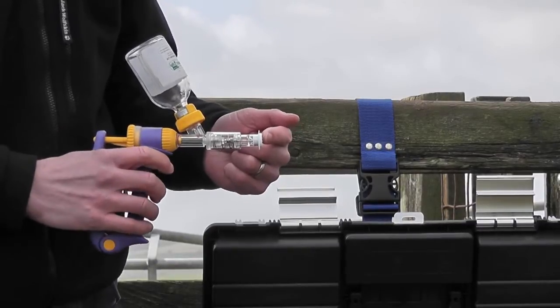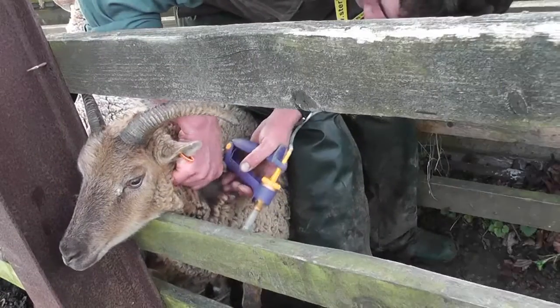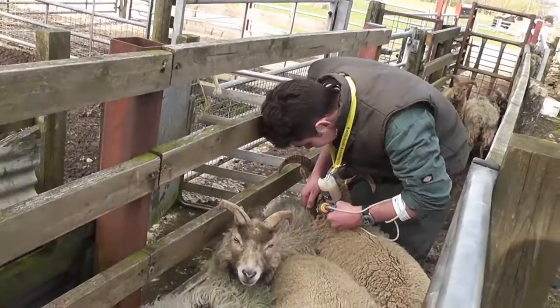Each Steri-Cap can be used up to 100 injections or three days from opening. We now see the system in use. To do a sub-Q injection just grab a fold of skin, insert the needle and deliver the dose. So you're just injecting as normal.